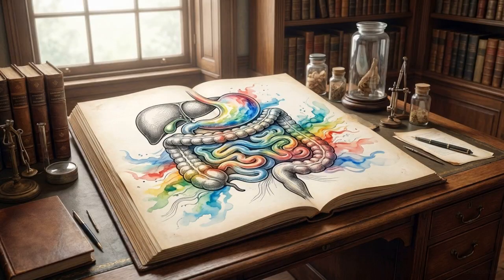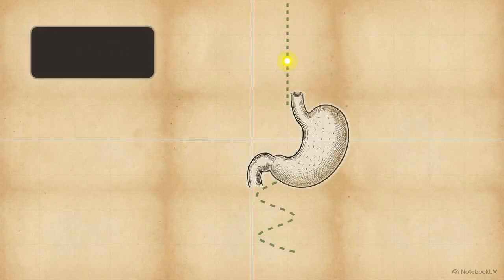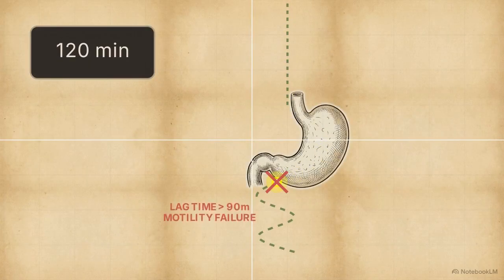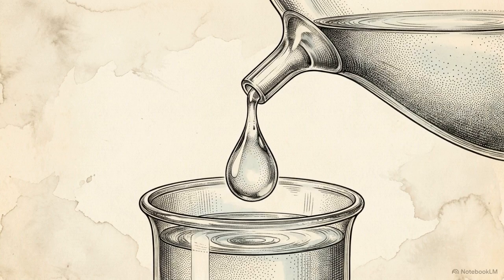Because the human body is constantly processing these components, a GI scintigraphy scan captures a moving target. Interpretation relies on a mastery of tracer kinetics. The clinician must know exactly where a radiopharmaceutical should be at any given second, and precisely why it might fail to reach that destination. Clinicians have to identify when biological artifacts are skewing the data, and they routinely deploy pharmacological agents to intentionally manipulate a patient's internal physiology.